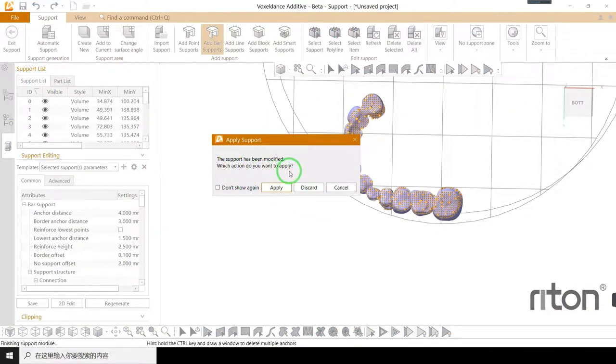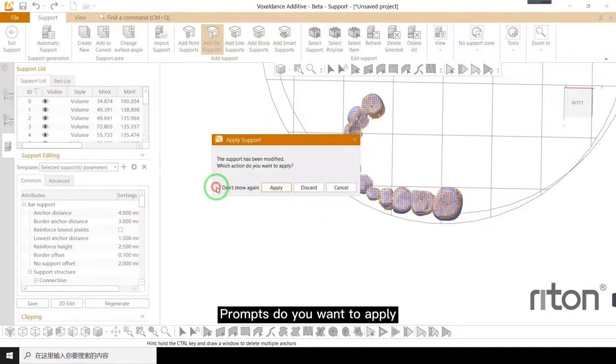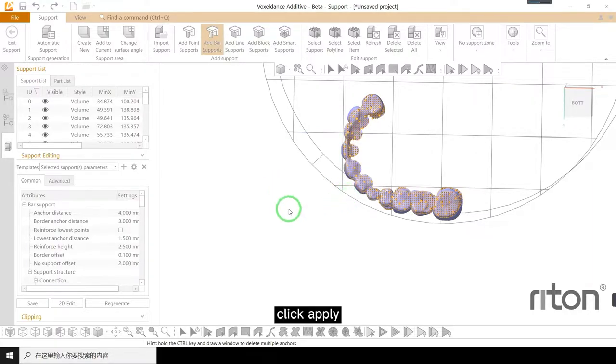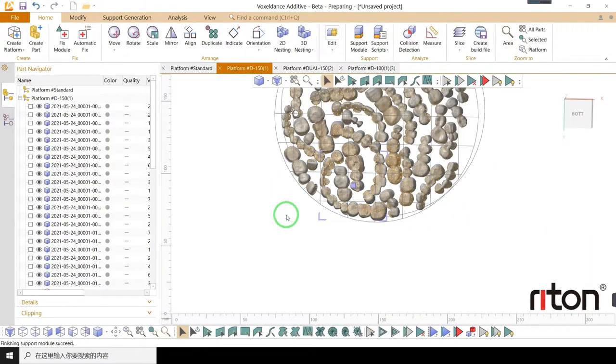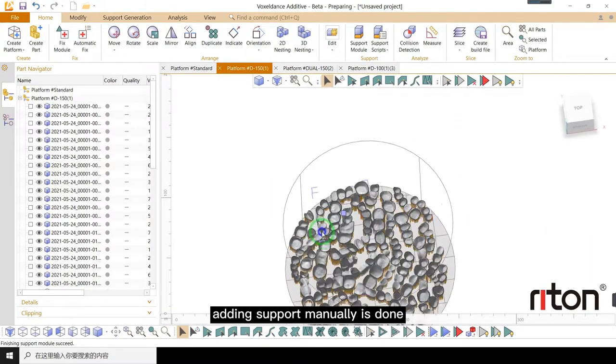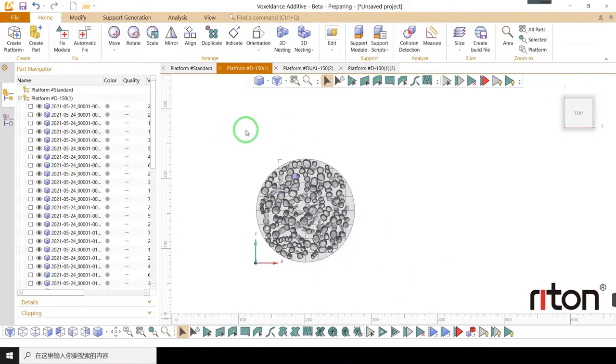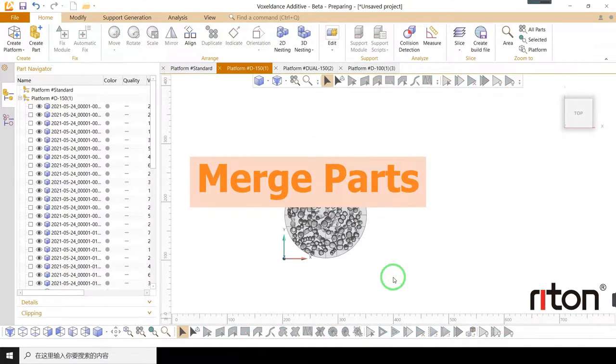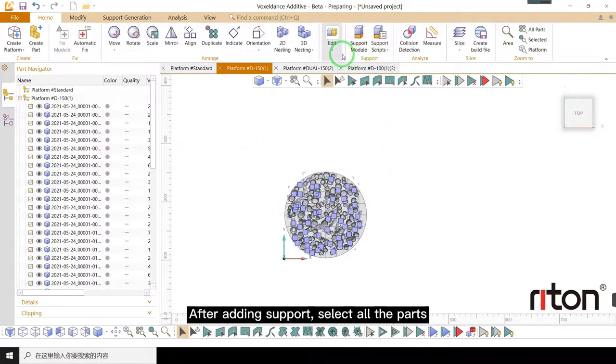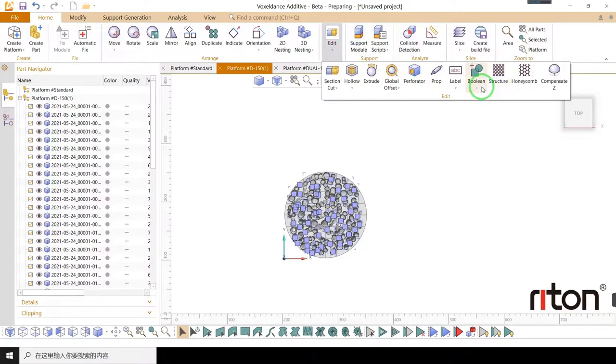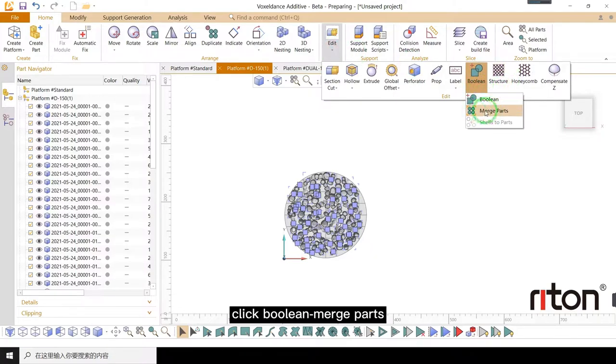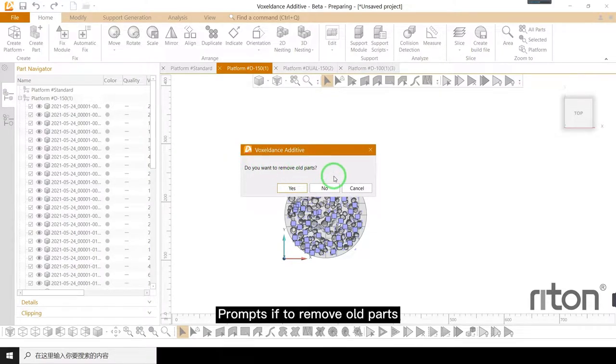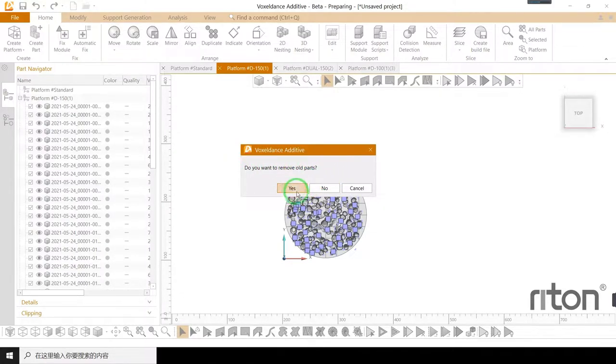Prompts, do you want to apply? Click apply. Adding support manually is done. After adding support, select all the parts. Click boolean merge parts. Prompts if to remove old parts. Select yes.